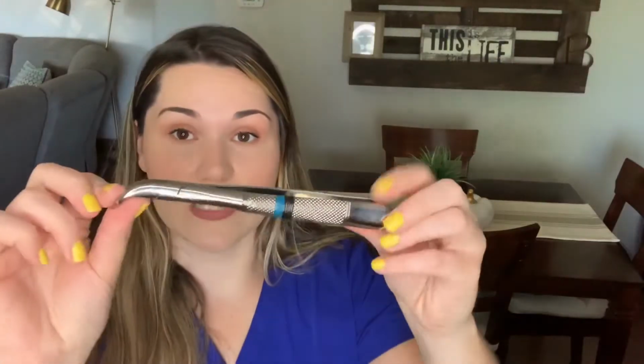Oops, can you guys see that there? It is labeled there. And so all forceps should have a number on them. I think I've only run across 1 or 2 forceps that didn't, but they all should be labeled with a number. And your dentist might have nicknames for these, but they usually just go by the number, especially when you're first starting out assisting, just to help you learn them. So this is a lower forceps. This is used on a lower molar in particular. And it's shaped like this because it is designed to get underneath the crown of the tooth, like almost in the root surface, and kind of hook under the crown so they can wiggle it out a little bit easier.